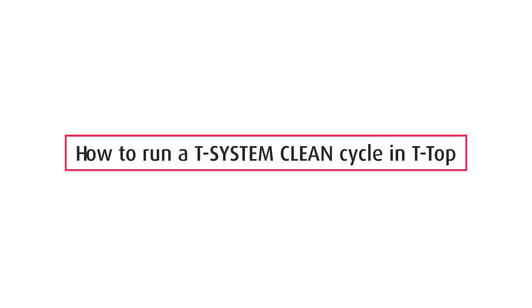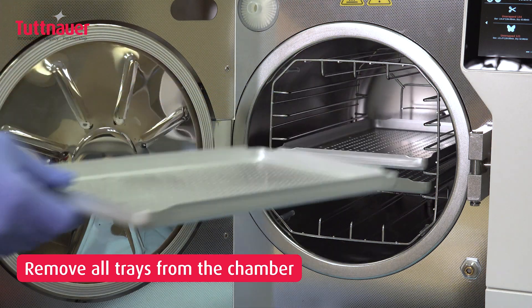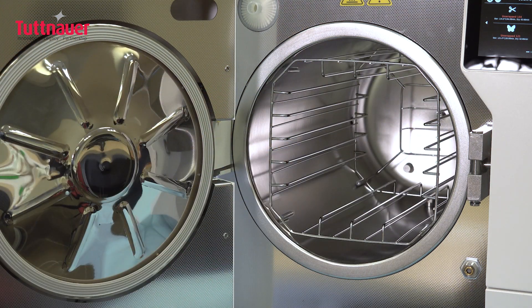Welcome to this quick guide on using the T-System Clean Cleaning Tablet with your T-Top System. First, empty the chamber by removing all trays in the tray holder.